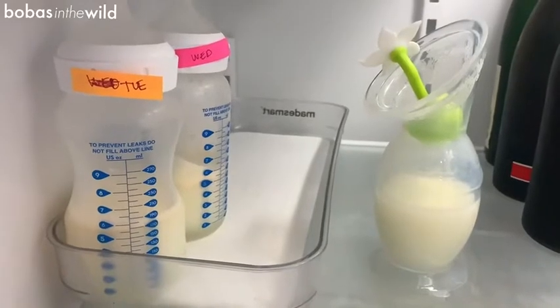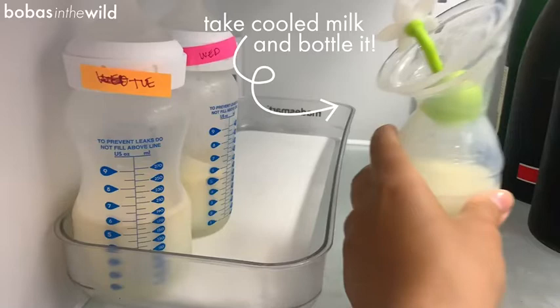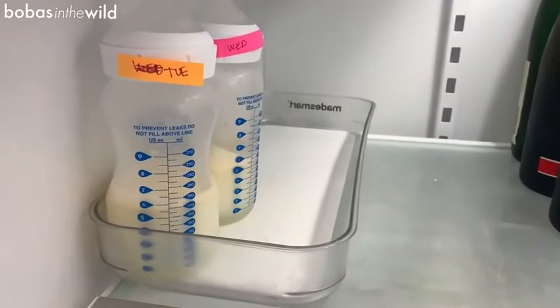When you're using your other haakaa, you have milk in it. Then you place it in the fridge. You take the original haakaa out and bottle it, freeze it, whatever you're doing with your milk typically. Then you just go and wash that one so that you have it ready to go for your third feeding of the day.